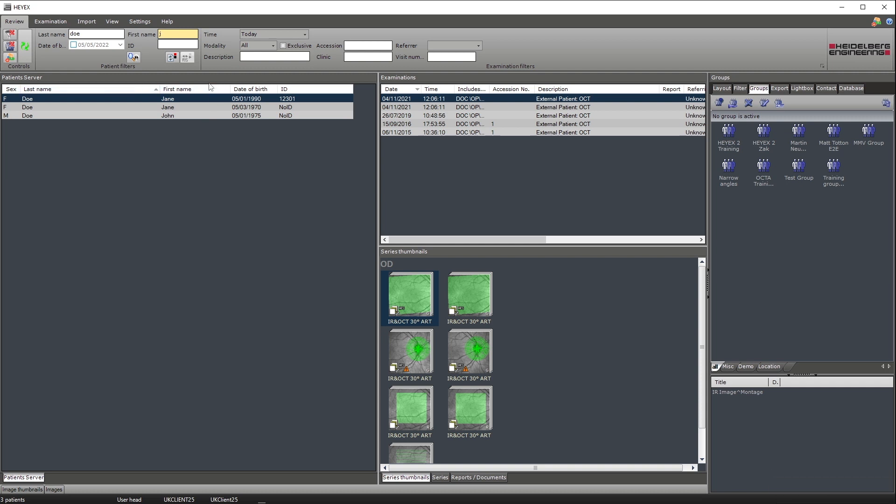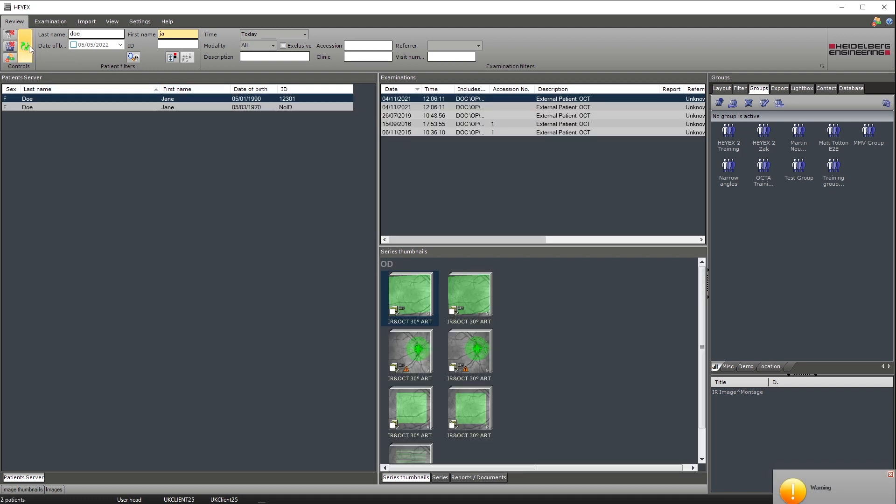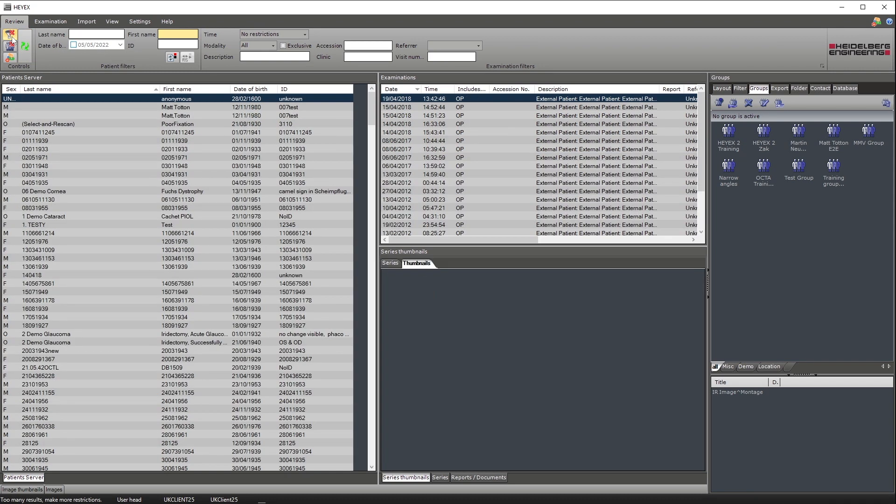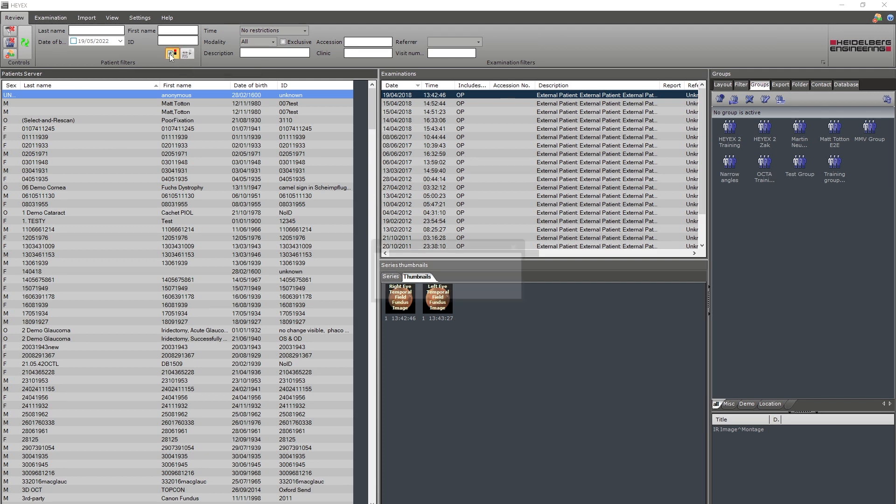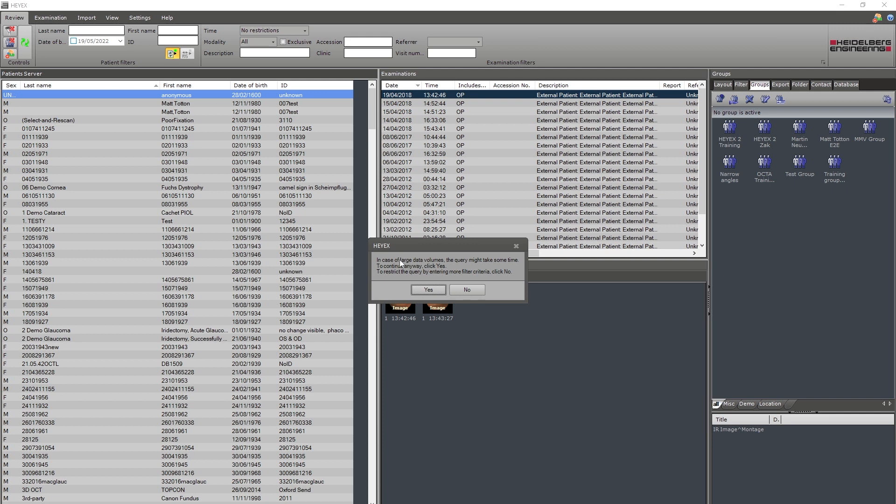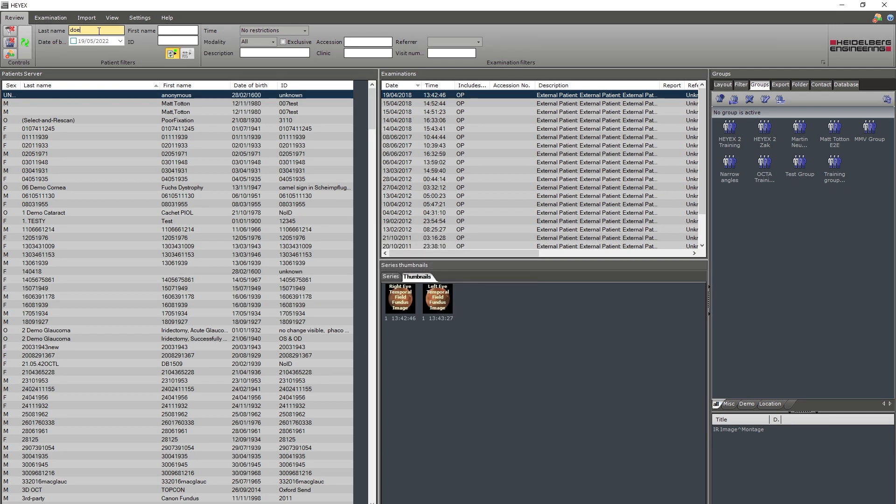You can also refresh the filters by using the refresh filter icon and clear all filters by using the reset all filters button directly under the review tab. You can also activate and deactivate the auto refresh function by clicking this button. Activating this will cause the patient server to be searched automatically as you type in the search fields.